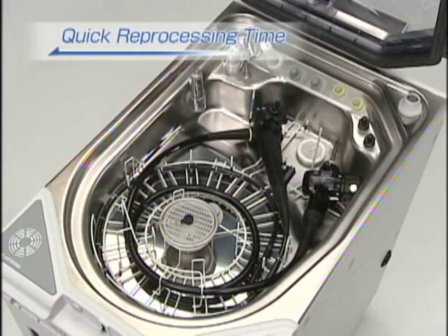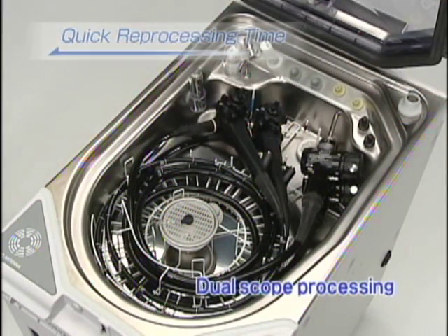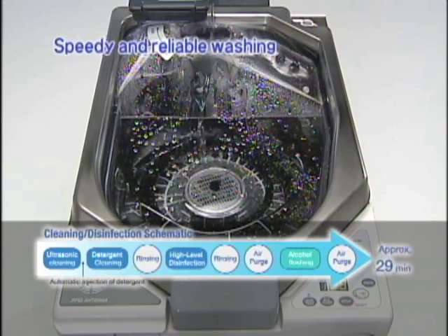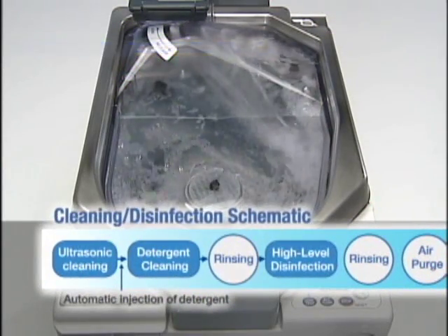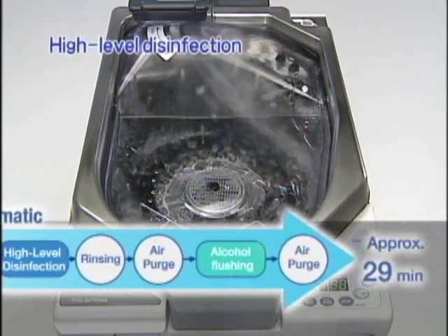The OER Pro has a compact design. It can reprocess two scopes simultaneously, and it can do so quickly. In about 29 minutes, the OER Pro washes the scopes reliably, performs high-level disinfection, and flushes them with alcohol — all automatically.